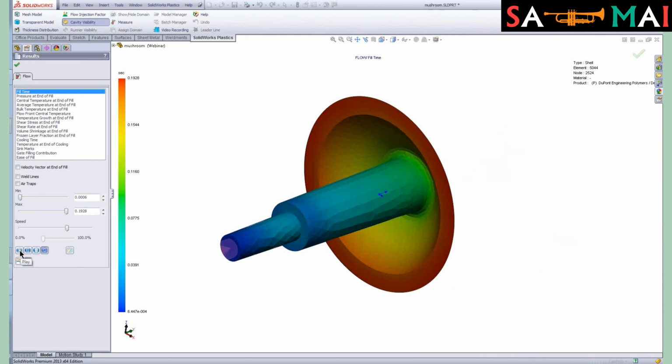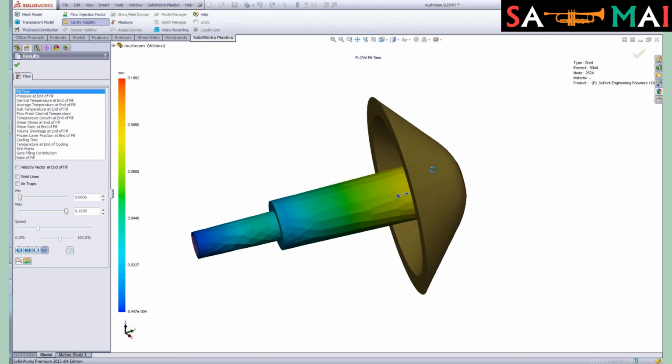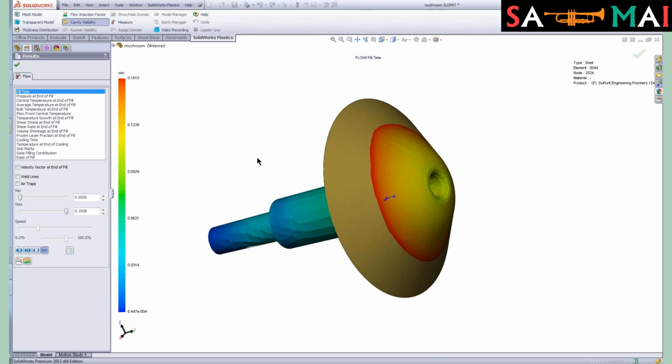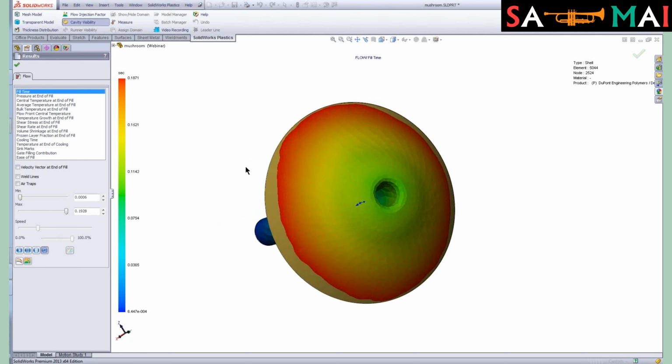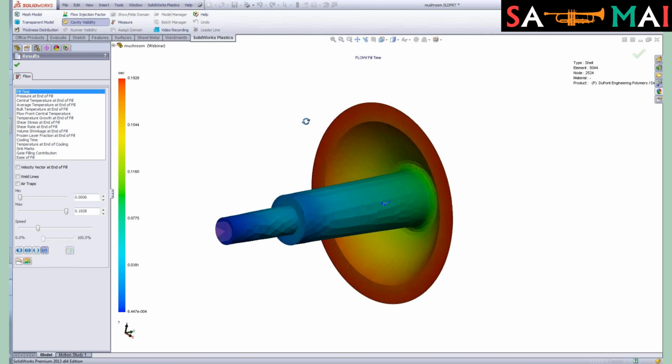First would be to just play a plot. So this would be the fill time. And you can see if I slow that down, that's the melt flow front that we're seeing traverse through the part from our gate to the outside edges of the part where it's going to fill right at the end. I'll go ahead and stop that.